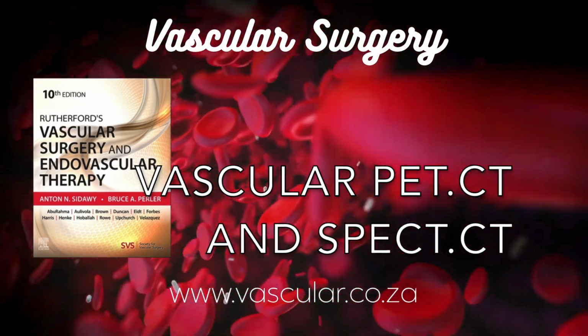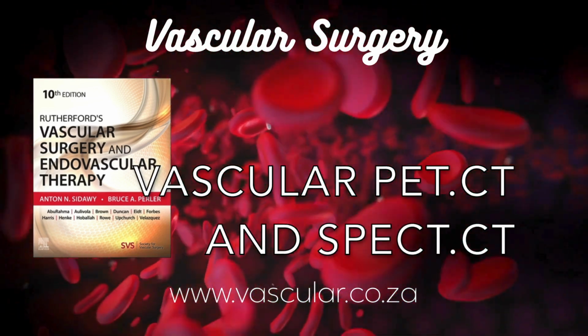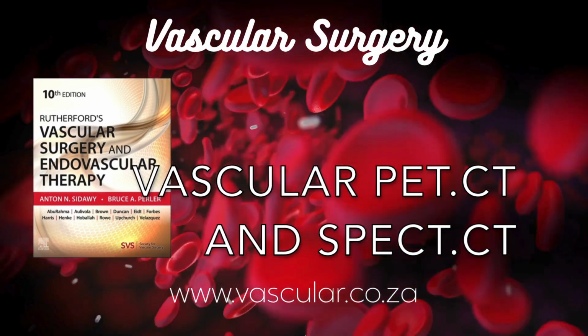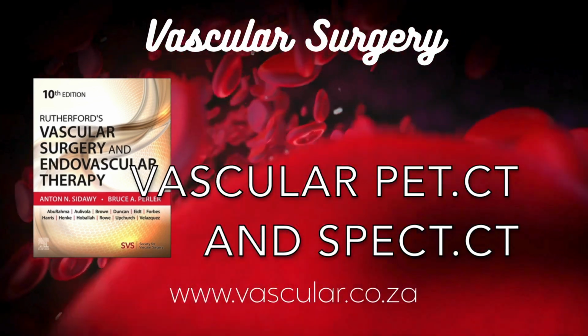Technologists and physicians always aim to use the lowest dose possible, the ALARA principle, and newer scanners and CT techniques are constantly improving, allowing dose reduction. But it's a factor, especially if repeated scans are needed. Absolutely. Benefit versus risk. Okay, looking ahead, what excites you most about the future of vascular molecular imaging?